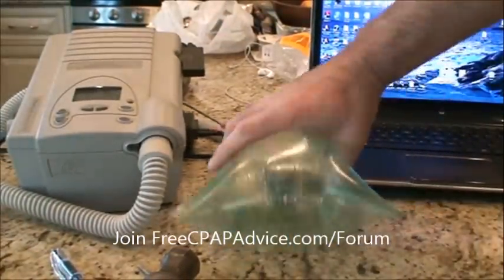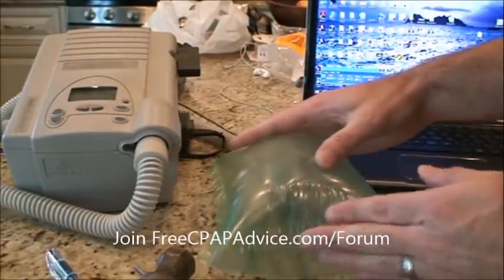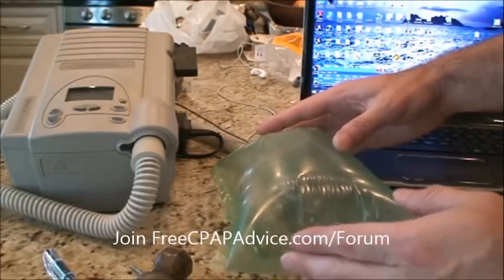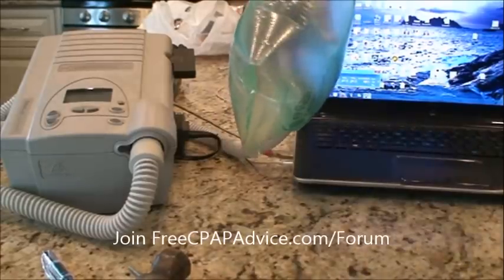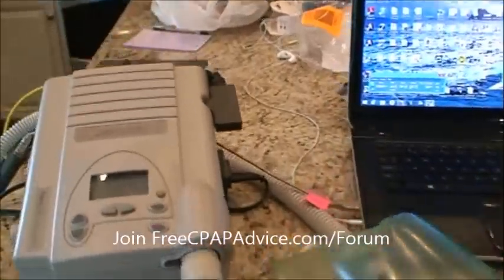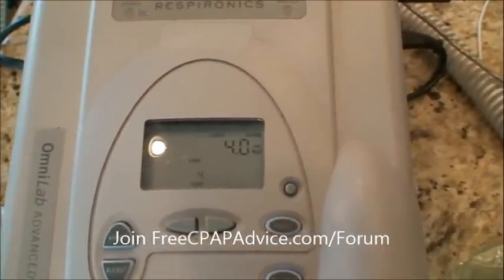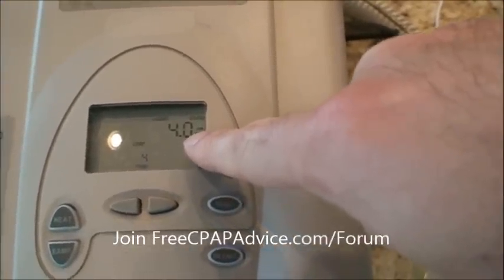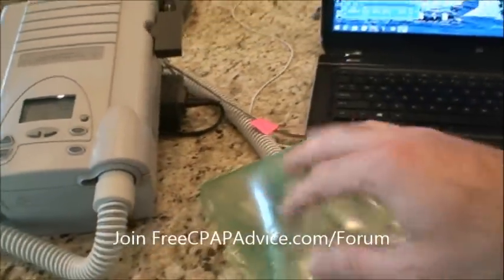Right here, this will be our fake person. I have a couple holes here in the front so that we have a little bit of air leaking out. I may have to add more holes later, but this is basically what you want your airway to look like, nice and big. Another thing we have up here is that it's blowing at 4 centimeters of water pressure. It tells you right here what it's supposed to be, and then up here it tells you what it actually is. That's the actual pressure being delivered to our fake lung here.